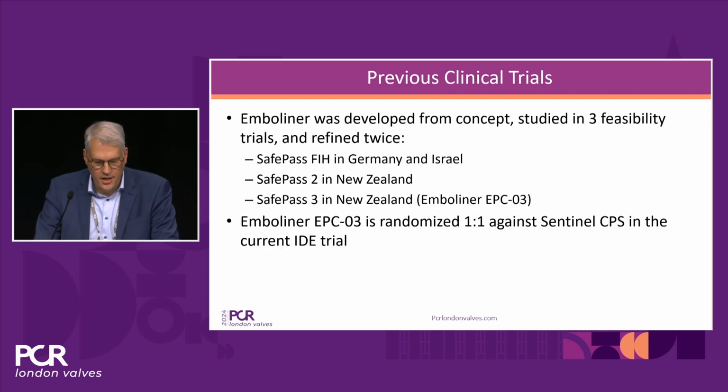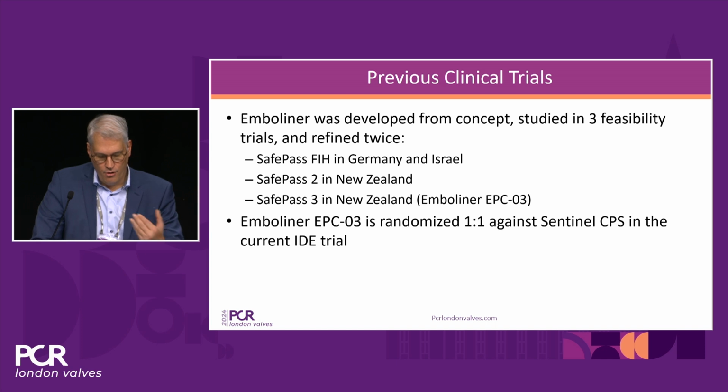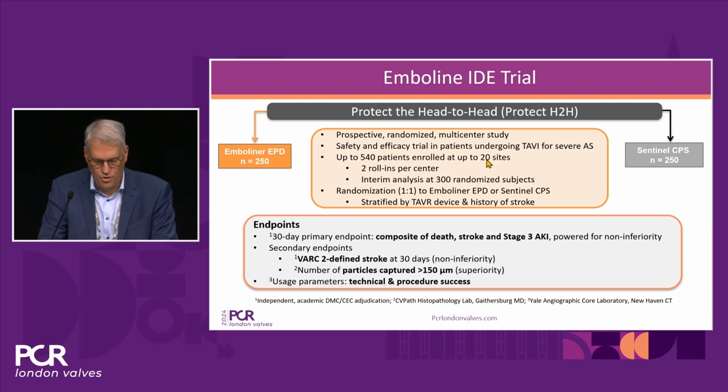That's pretty easy, and there are some clinical data around. There were some early studies performed in Germany, Israel, and New Zealand. And at the moment, there is an IDE trial going on, the PROTECT head-to-head trial, as you can see here. It's a rather large trial, given the fact that it is randomized.